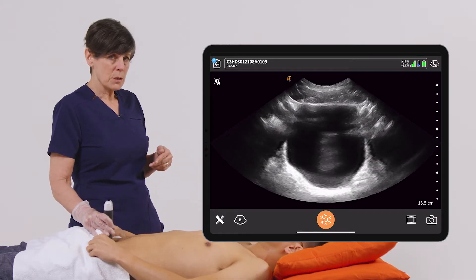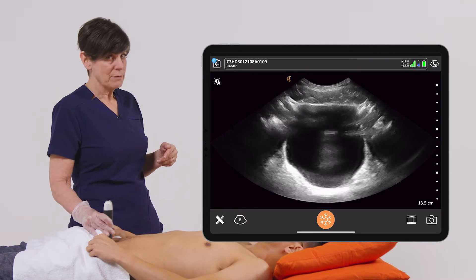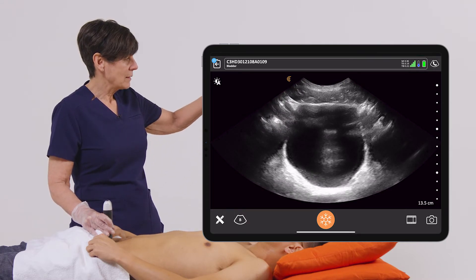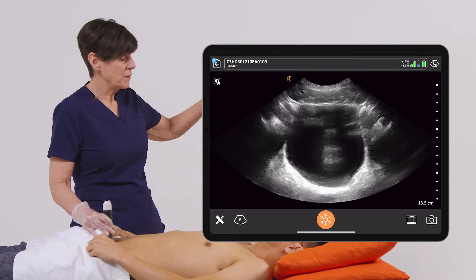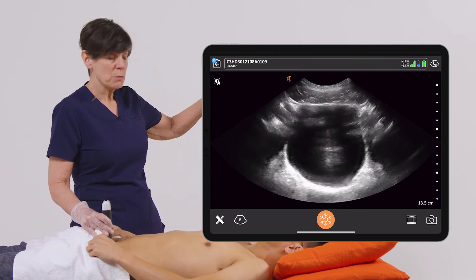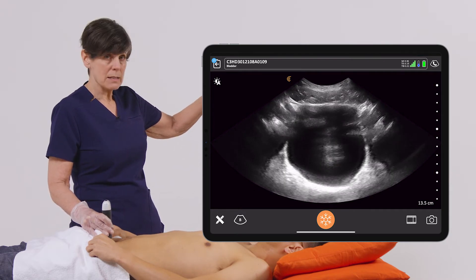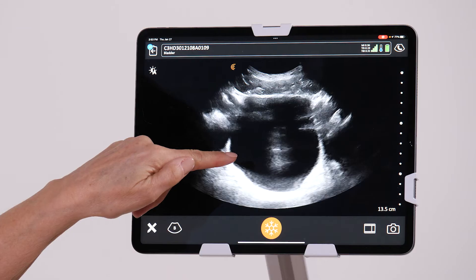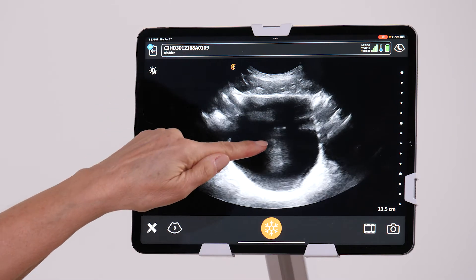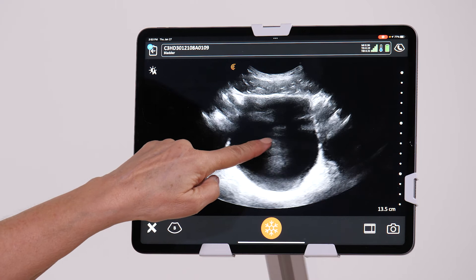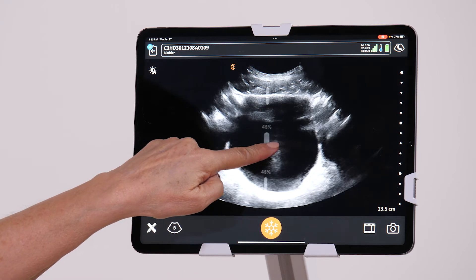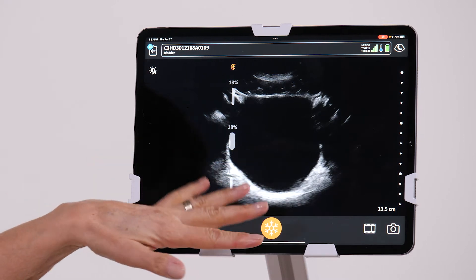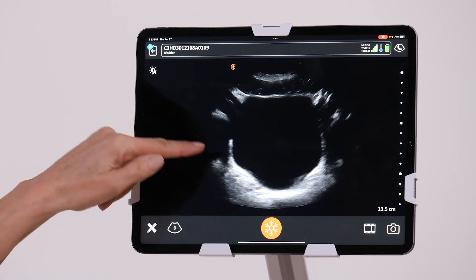In this situation, I've got a picture of a bladder — a very full bladder — and you can see that the bladder should be black because it's fluid filled. It's a little bit too bright and I'm seeing some echoes inside that I know are artifact. I can deal with that by decreasing the overall gain by holding my finger on the screen and just lowering the gain. I've gotten rid of a lot of those echoes in there.